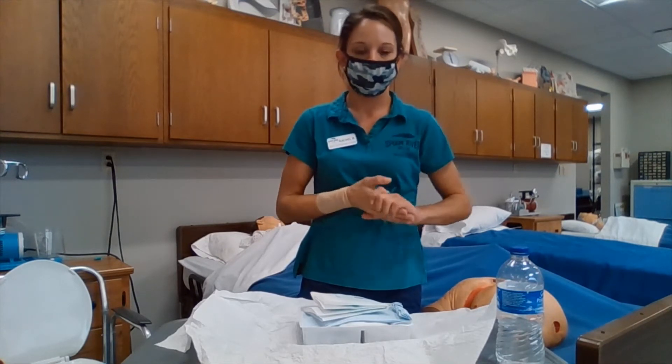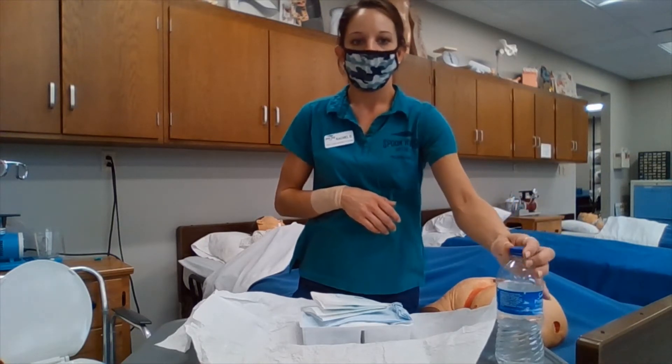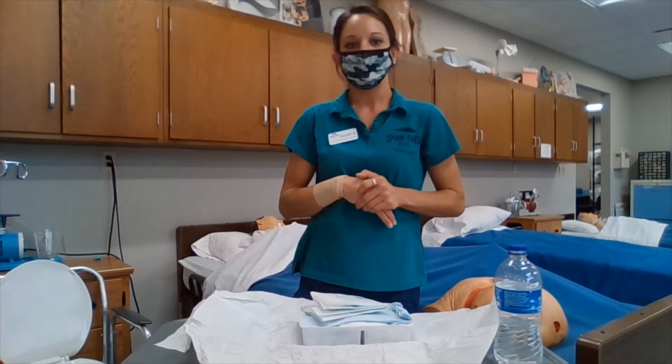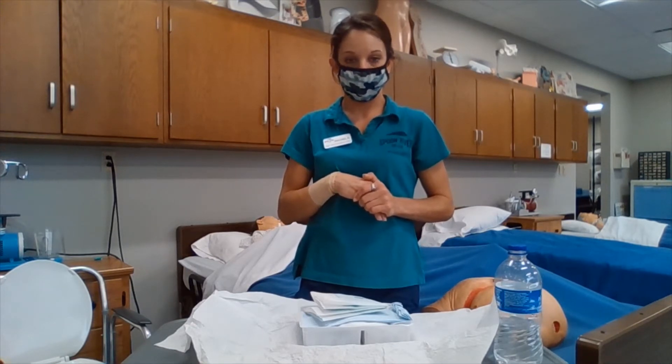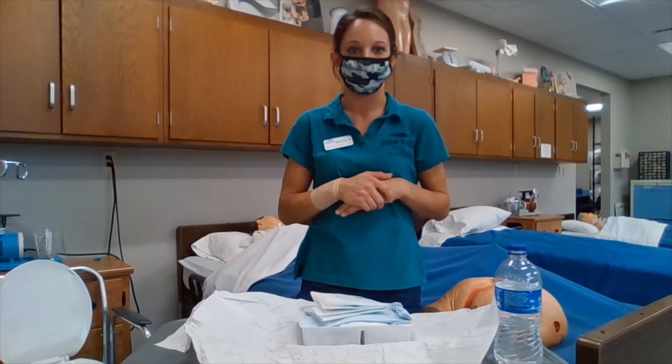The next thing we are going to do is uncap our solution because we will be using that here shortly. Then our next step would be donning just one sterile glove, and that is going to be on our dominant hand.